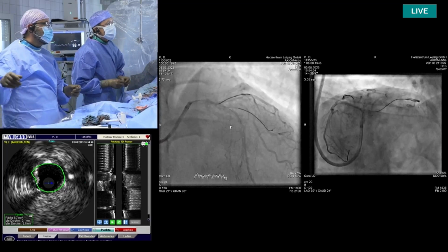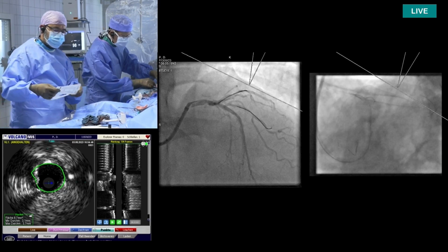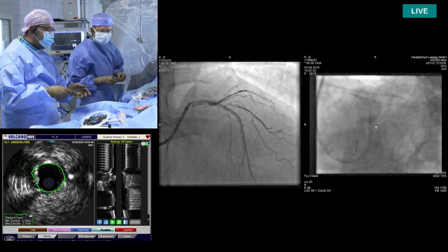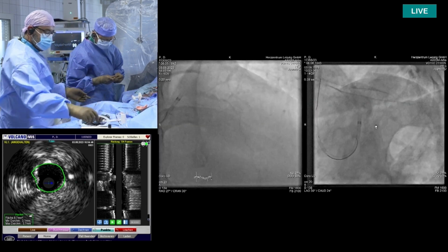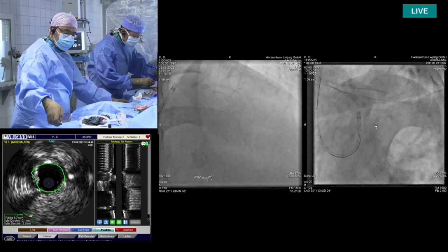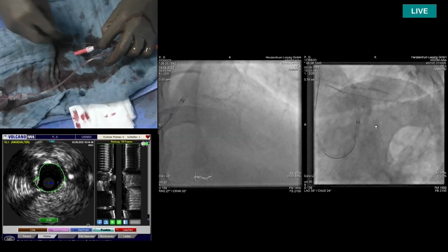So Mohamed, obviously no objections with the strategy. I think it's fine to go with stents, but I have to say personally, and notwithstanding my obvious bias, I would definitely use a Rotacut strategy based on your own trial, the PREPARE-CALC COMBO, because there's still a lot, we don't see a lot of fractures. So for the audience, it's also an option now to go with a cutting balloon or Shockwave before stenting in this case. Yes. But stenting should be fine.